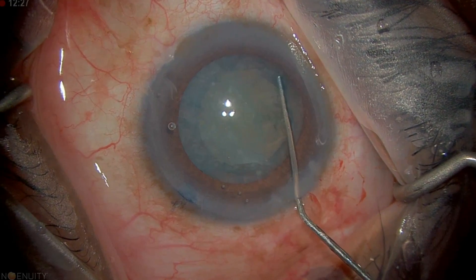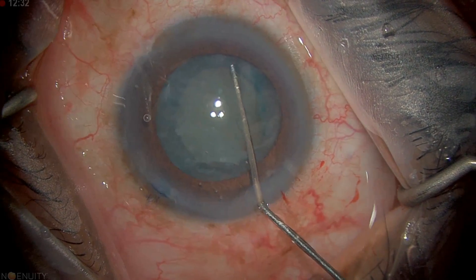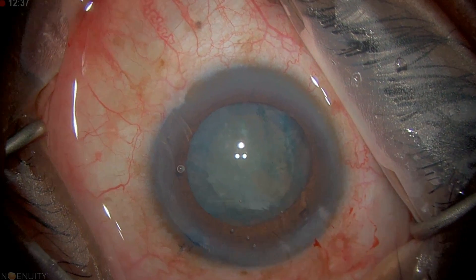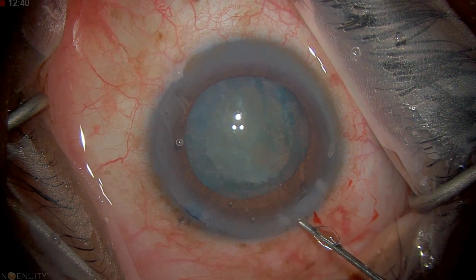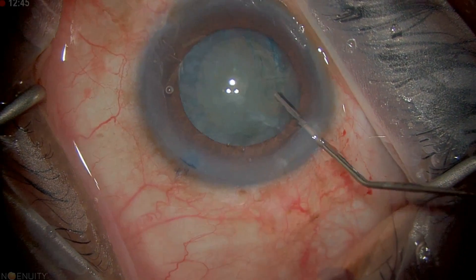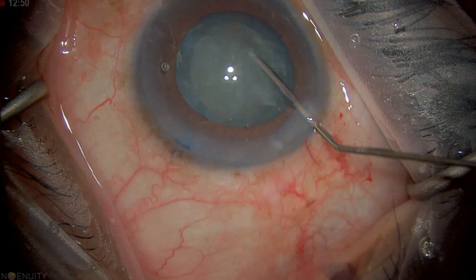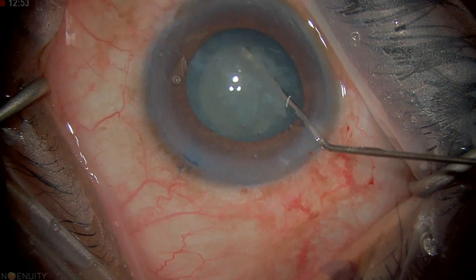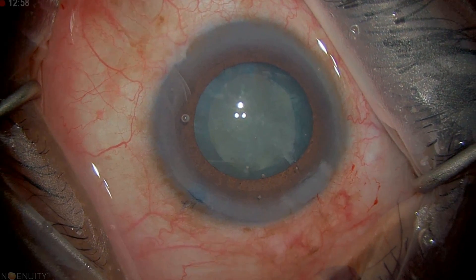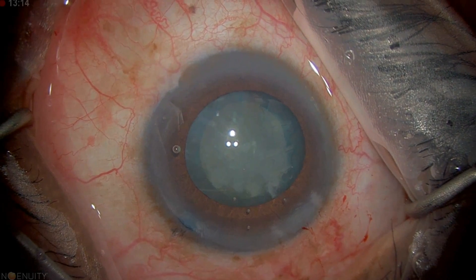Anterior capsular block is where fluid gets behind the lens, pushes the lens up against the capsulorhexis edge, and when you infuse more fluid you get a rupture of the posterior capsule. I infuse the other side as well and now I'm going to see if this lens rotates. I always tell my trainees: hold the cannula like a pencil, start from the left and try to rotate to the right — if that doesn't work, go the other way. We have some rotation, so we're ready for nuclear disassembly.